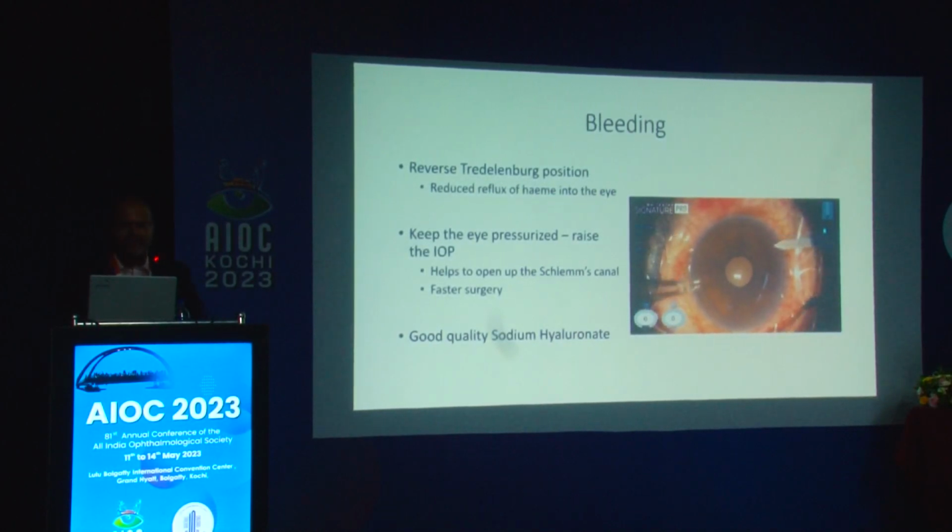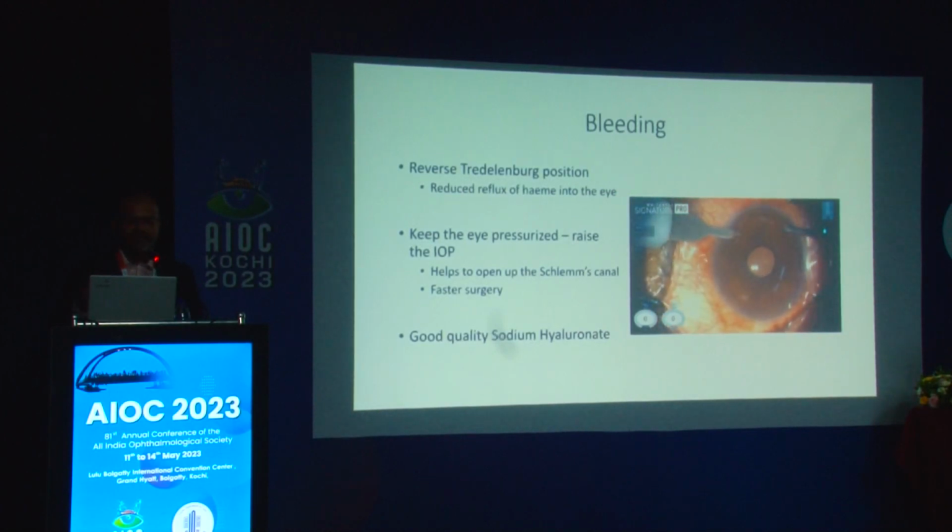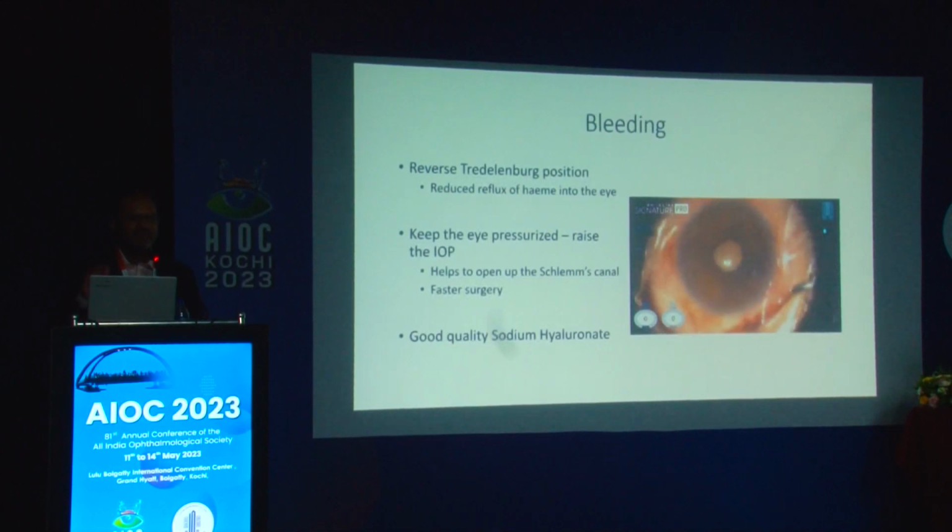And when you keep the eyes pressurized, it helps to open up the Schlemm's canal. Schlemm's canal is like a rubber tube in a tire which has got punctured. So it just collapses. You introduce something into that, it will go and kink somewhere. So Schlemm's canal, if it has to be cannulated, my afternoon talk is on canaloplasty. I do the same procedure externally. So if the suture doesn't go, that means somewhere the Schlemm's canal has kinked. So inflate the eye properly.